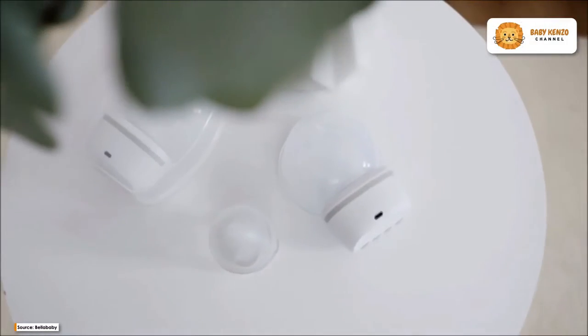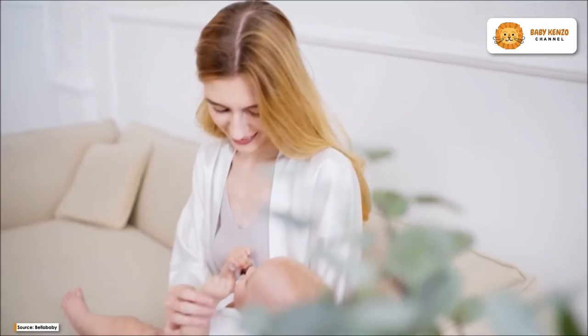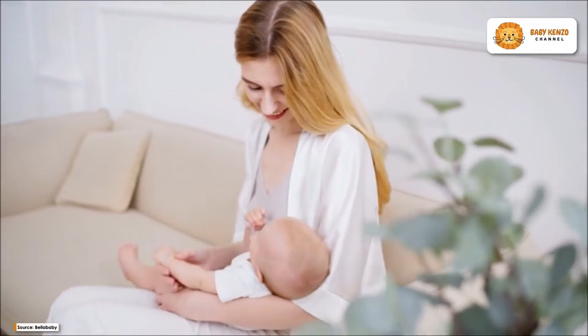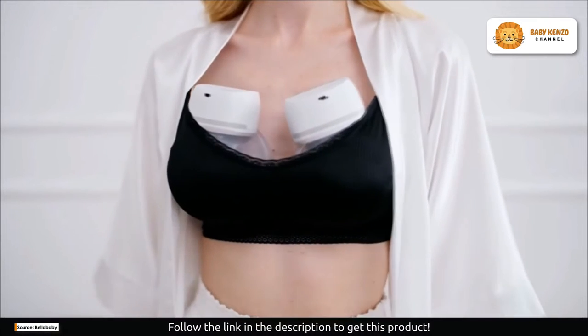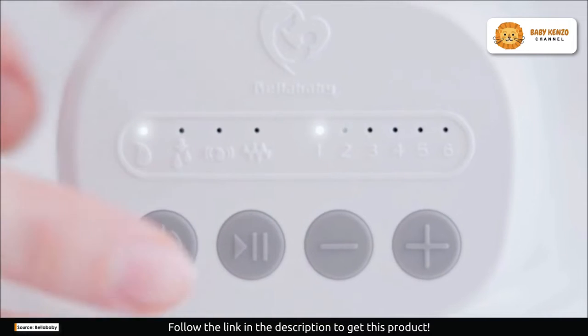Introducing the Bellababy W42, the game-changer in the world of breastfeeding. Moms, get ready to experience a newfound freedom with the Bellababy Wearable Breast Pump. This is not just a pump, it's a revolution in convenience and comfort.